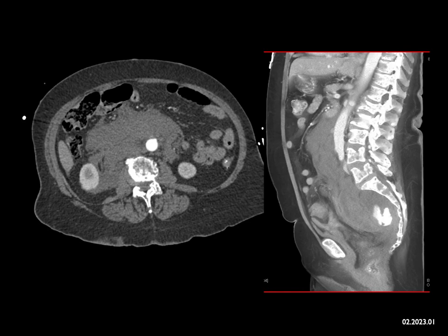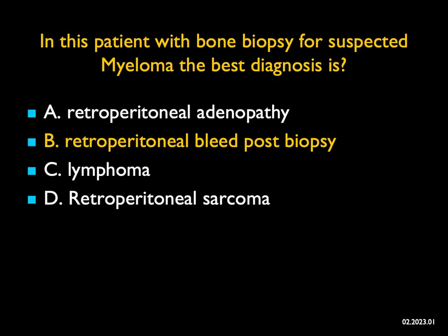So what is this? It's a soft tissue mass of relatively high density. It doesn't have the consistency of adenopathy — it's not nodes and it's not lymphoma. You can think about a retroperitoneal sarcoma, but it's so homogeneous. The patient had a biopsy. It looks like the patient has myeloma, and this is a really nice example of a large retroperitoneal bleed post-biopsy.